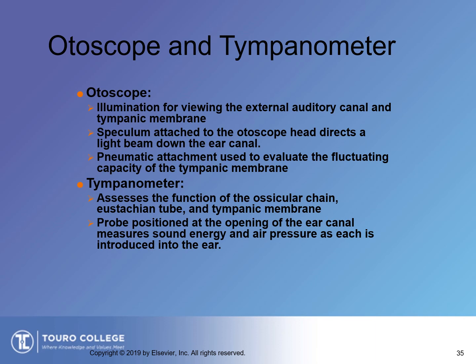It looks like a little tube that's got a bulb on it. Especially in pediatric patients, when I'm looking in the ear, I will compress the little pump to look and see how their eardrum moves. It should be nice and brisk, moving back and forth. If it isn't, that can indicate that they're having some issues with fluid in their middle ear.